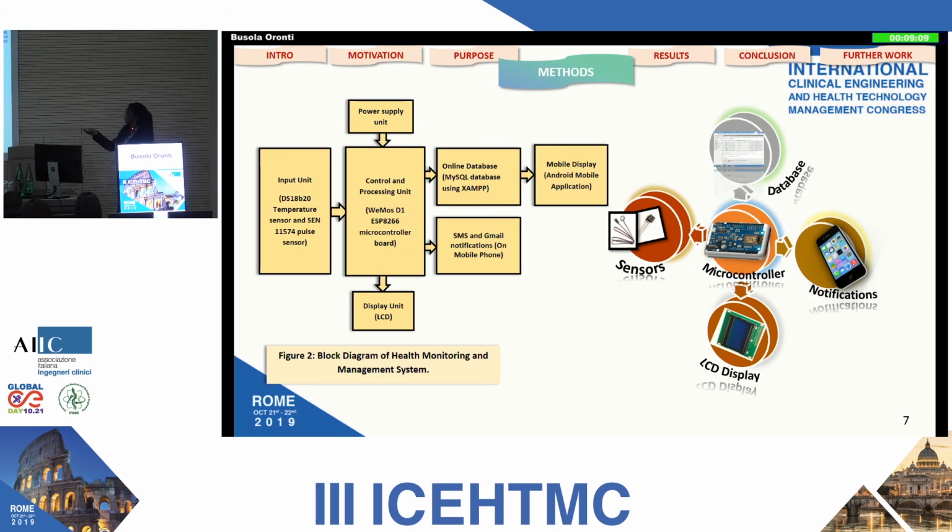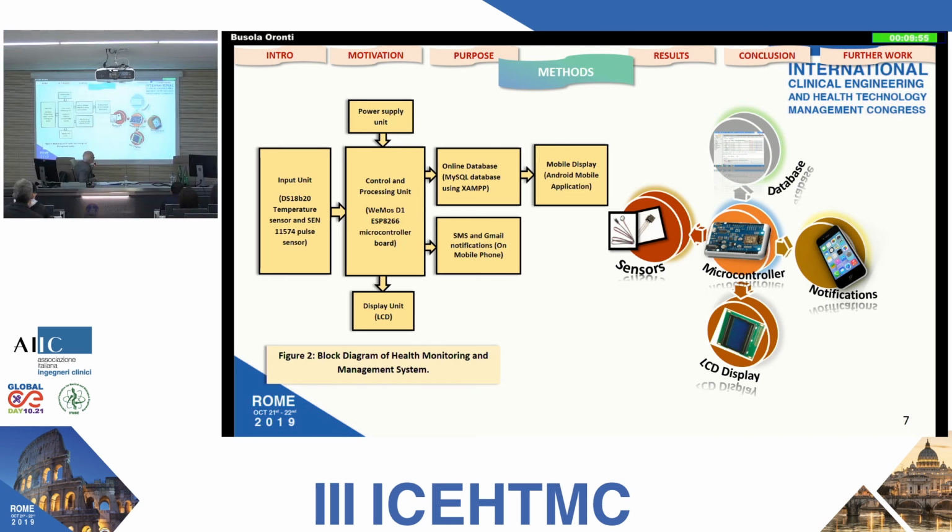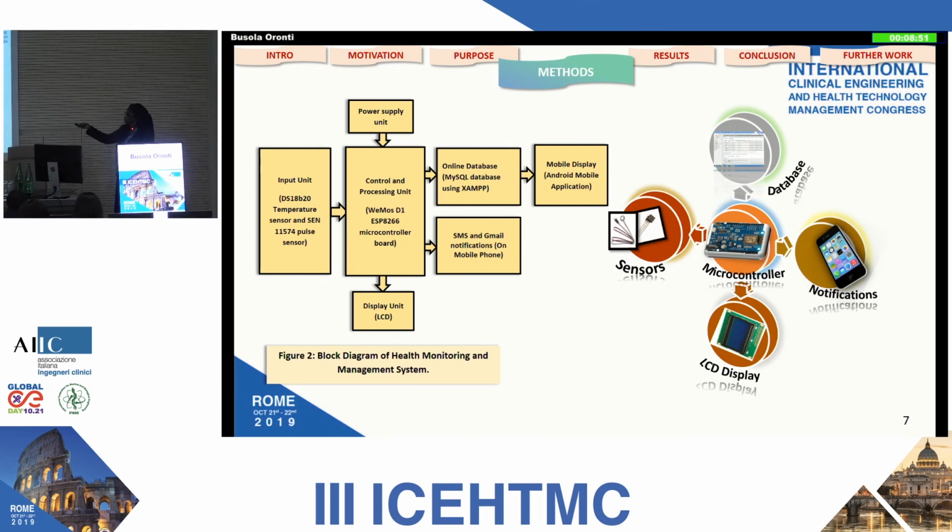So that's why we arrived at this. This is the manufacturer's ID for the sensor, that's in the input unit there. And also we have the pulse sensor. That's there. So those two considerations went into picking what sensor we would use. Yeah. Okay, thank you.